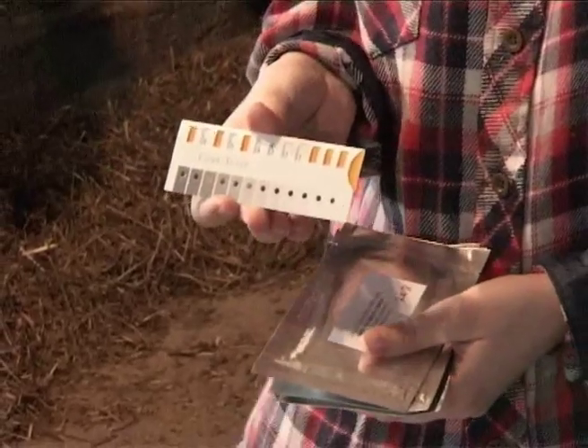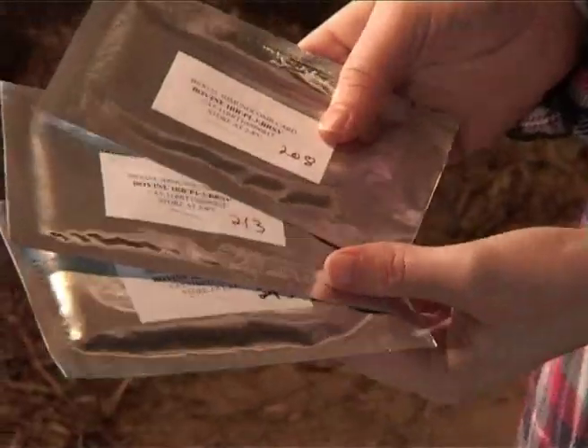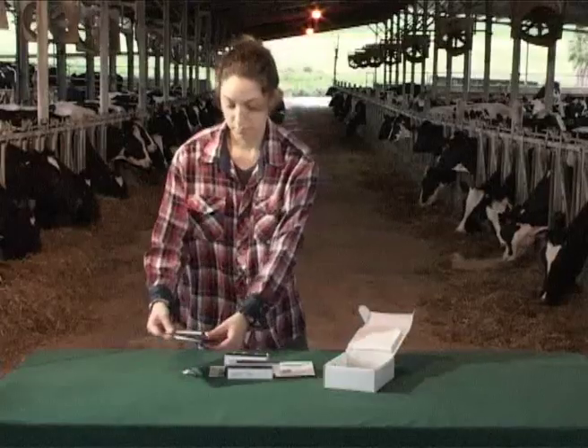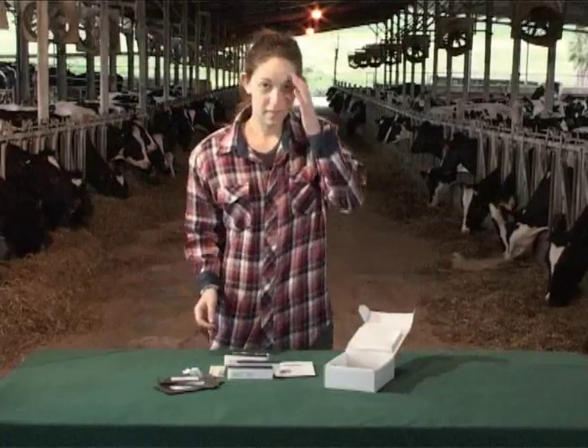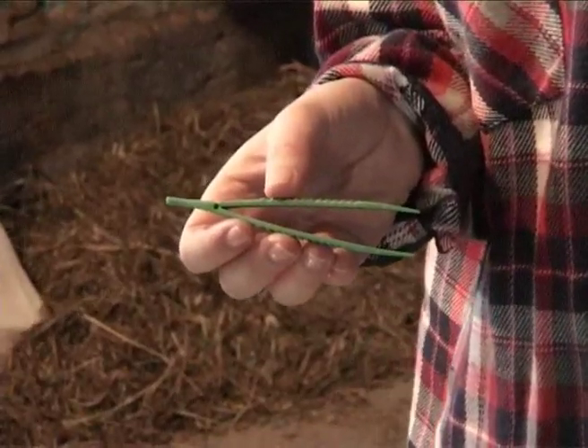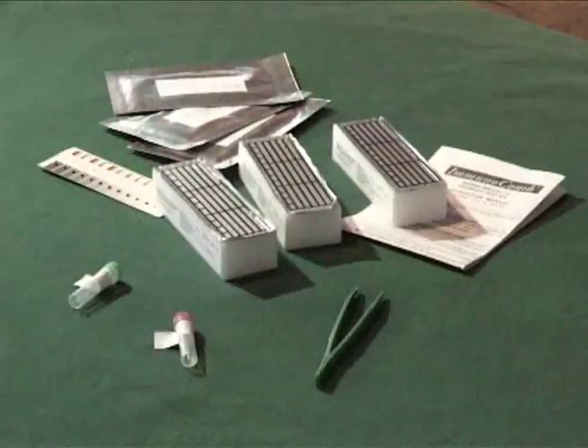The kit also includes a color scale known as a com-scale, three combs of immunocomb wrapped separately, and a plastic tweezer layer to facilitate the opening of the compartments.